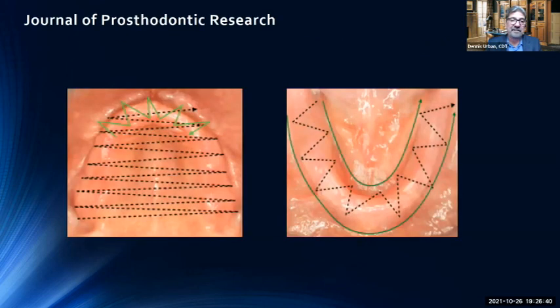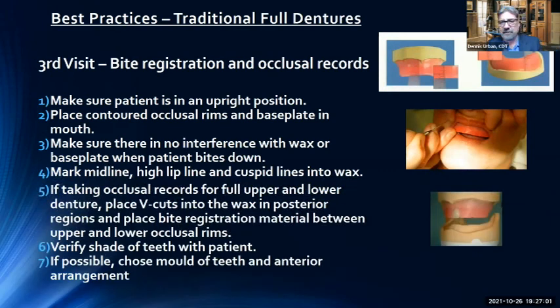But look at their directional impression. They went in a completely different direction. They were going back and forth across from one side of the ridge to the other, and they weren't getting accurate impressions. So maybe if they used Dr. LaRusso's technique, they would have gotten more positive results on this research here. But we'll touch on that in a little while, as far as digital scanning.